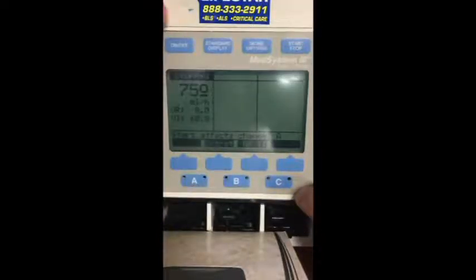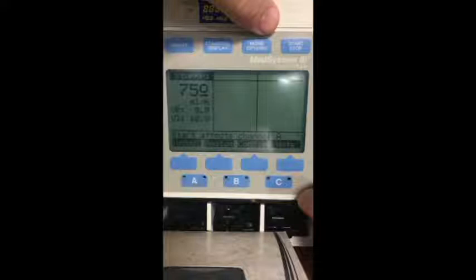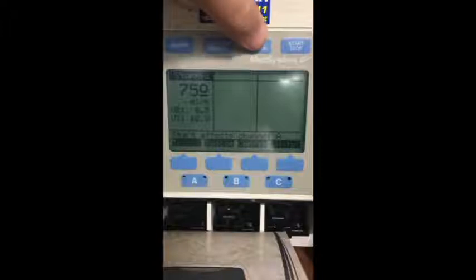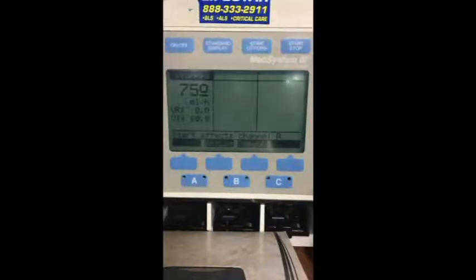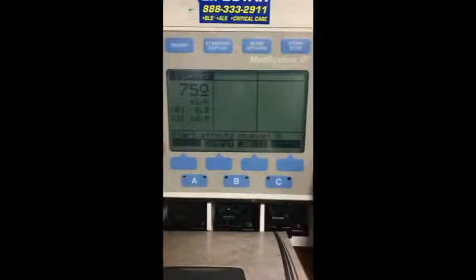So we have our on-off key. Our standard display takes us home. More options gets you to several different options that generally you never ever have to mess with. If you hit it multiple times, you get different ones. You don't really need any of those. Here is your start and stop button, obviously. And then channel A, select channel A, B to B, C to C.